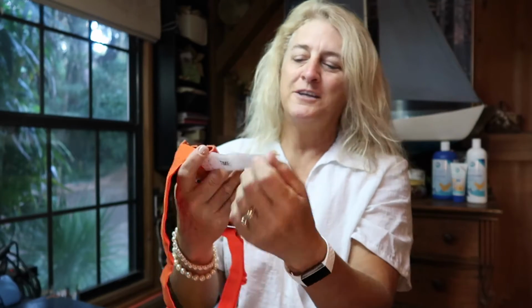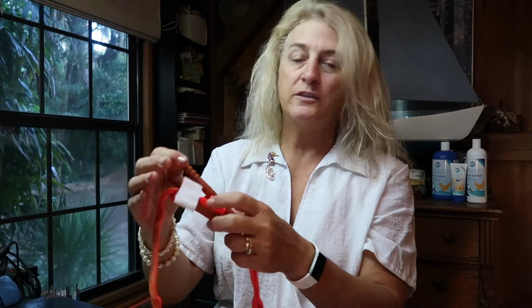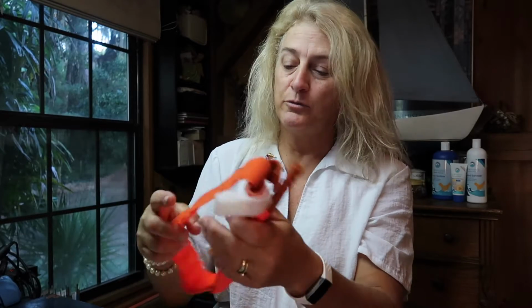And no, you do not release this every 20 minutes. If someone is in a situation where they really are bleeding badly and you think that they're going to bleed out and die in 3 or 4 minutes, and you don't have time to get to anyone on shore, get any rescue to come to you, and you decide you are going to use a tourniquet, it's not a guarantee that that person is going to have that limb amputated.